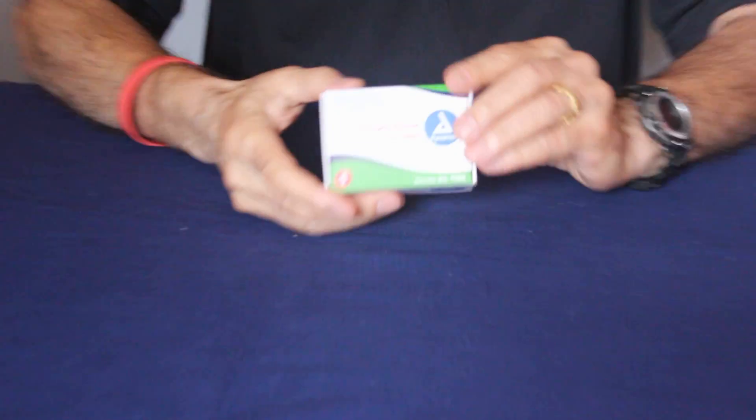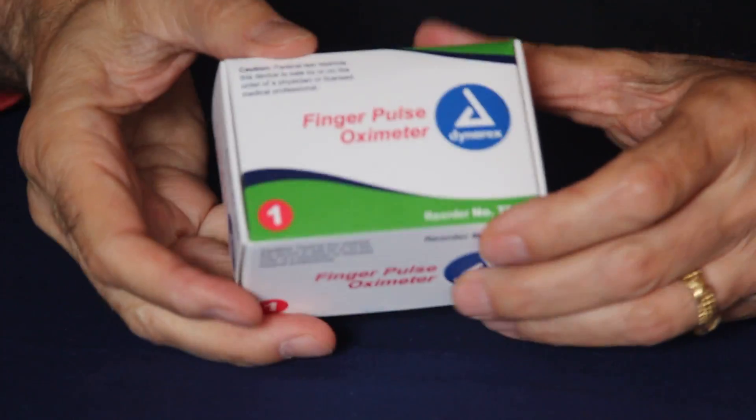Today we're going to talk about pulse oxygenation. This is a finger pulse oximeter. This unit is included in your kit.